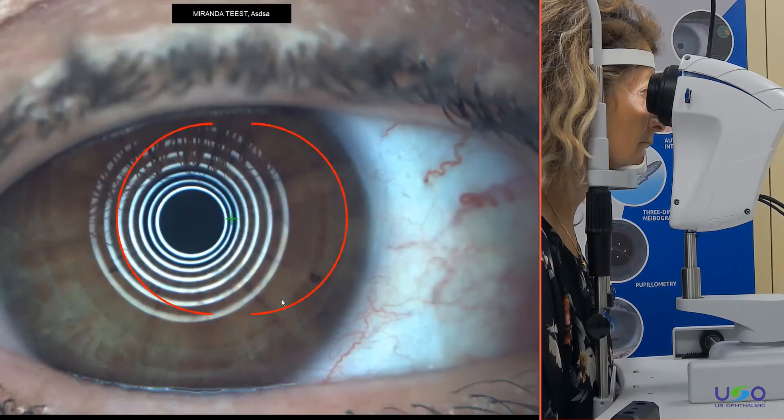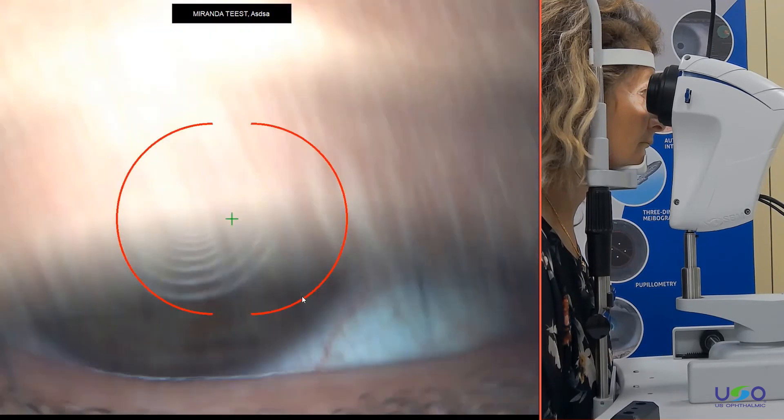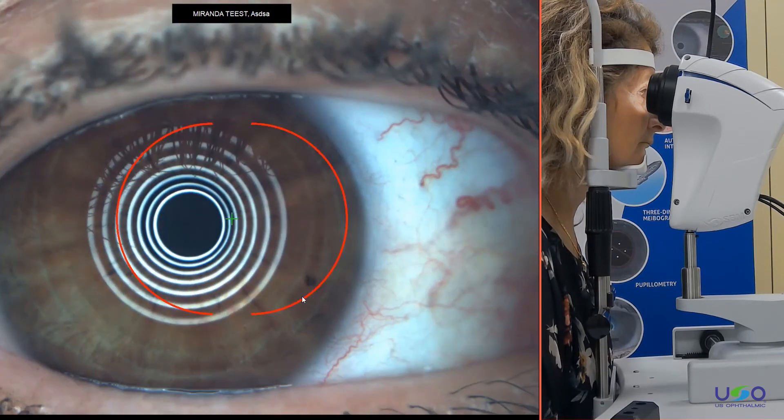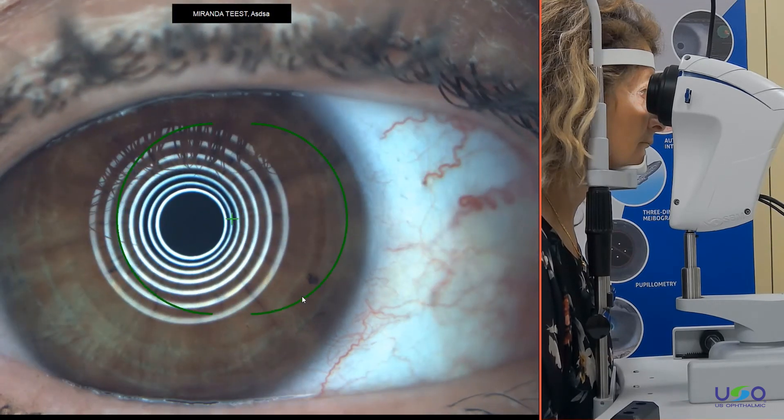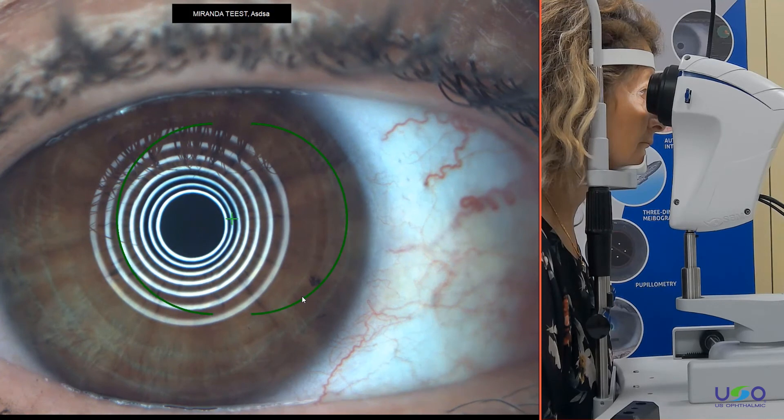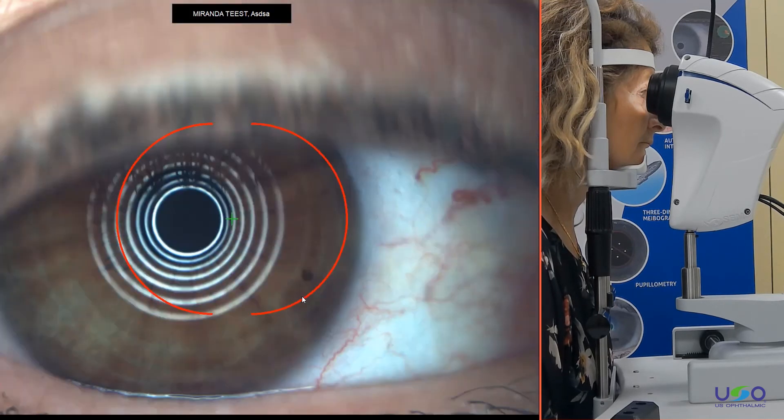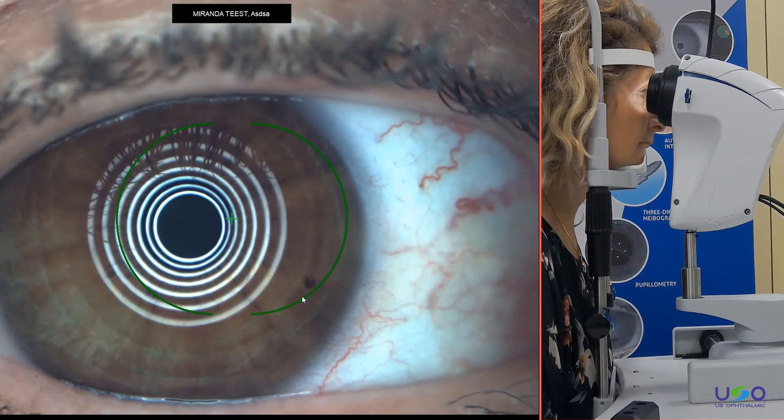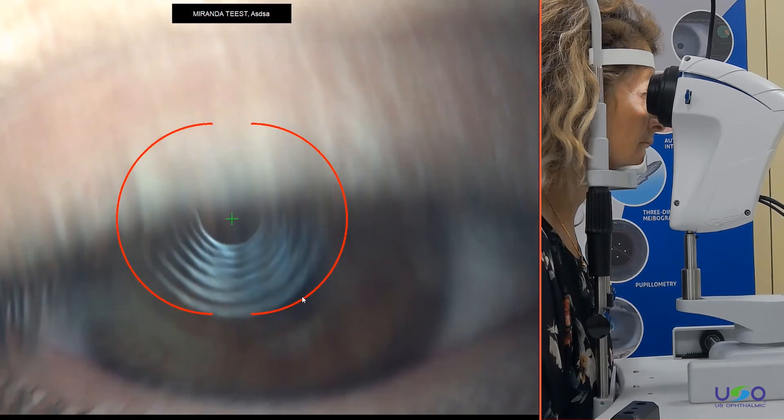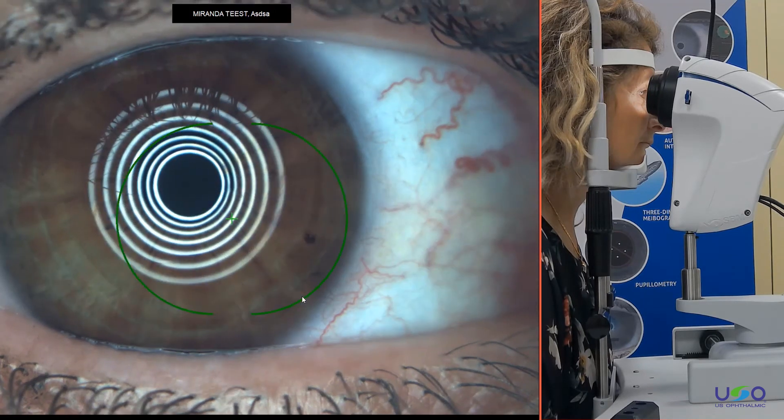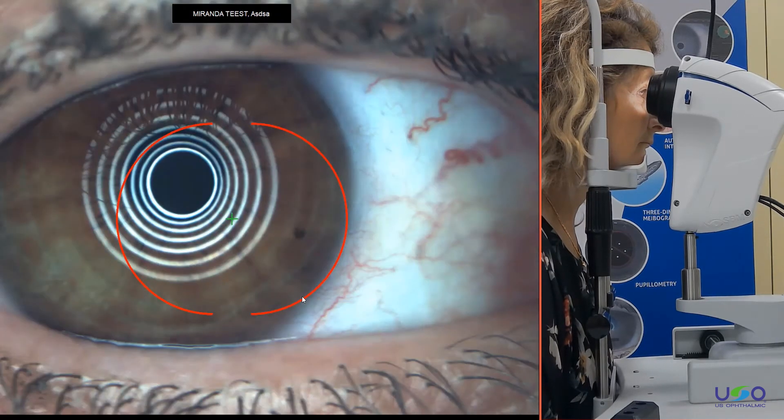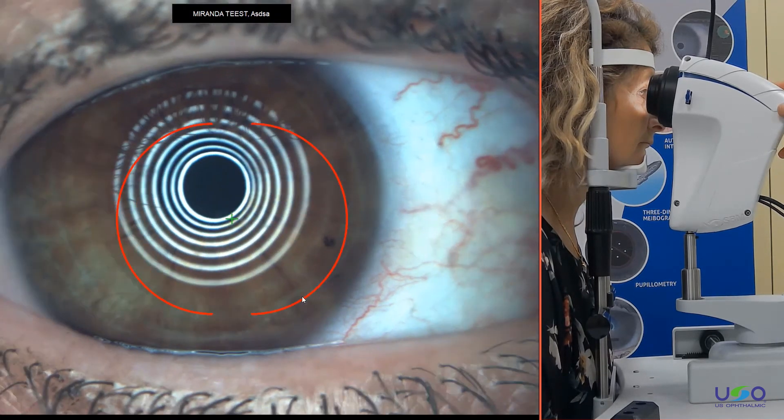So this is a new indicator telling you if the picture is on focus or not, so you don't waste time after taking the video when the software will tell you, okay, you cannot analyze it. So this is a new tool helping you in the detection of the focus. Now we go on focus on our patient.